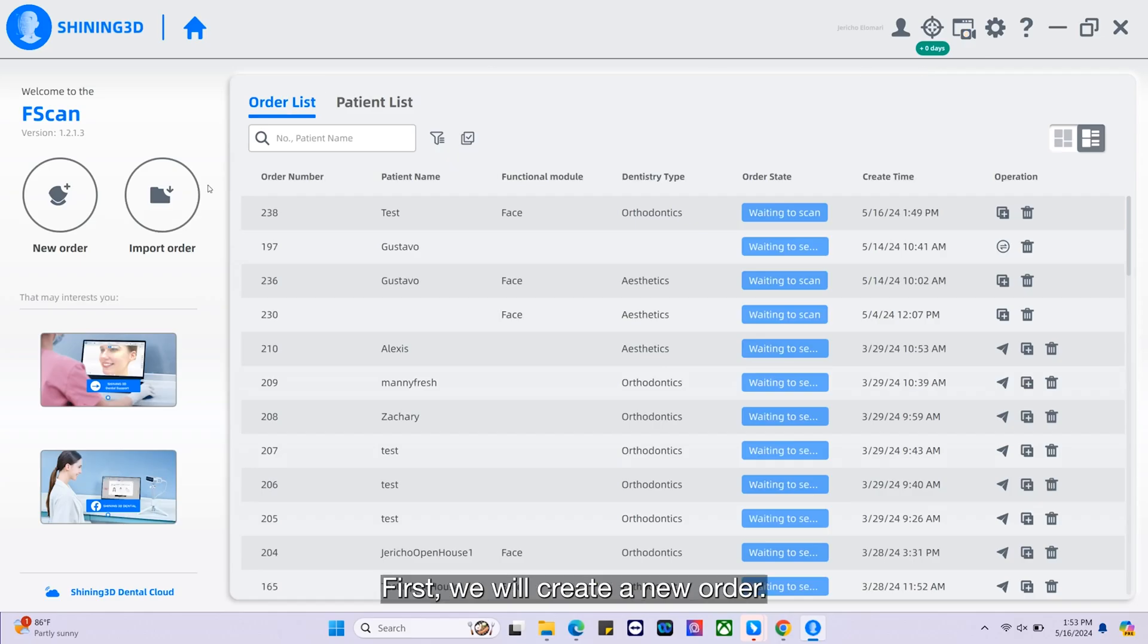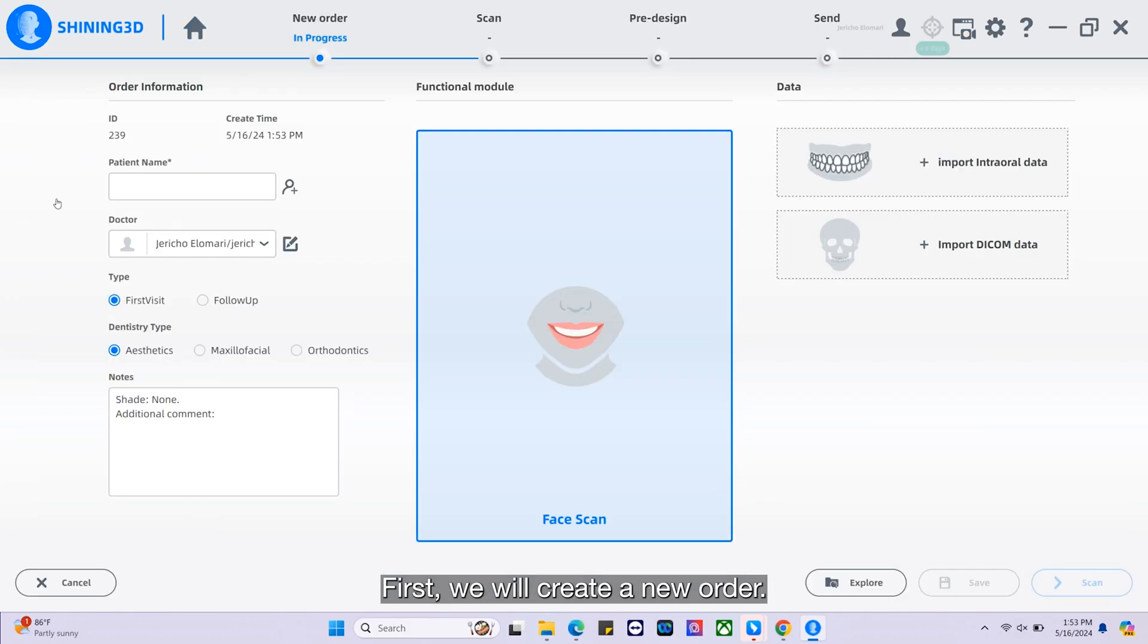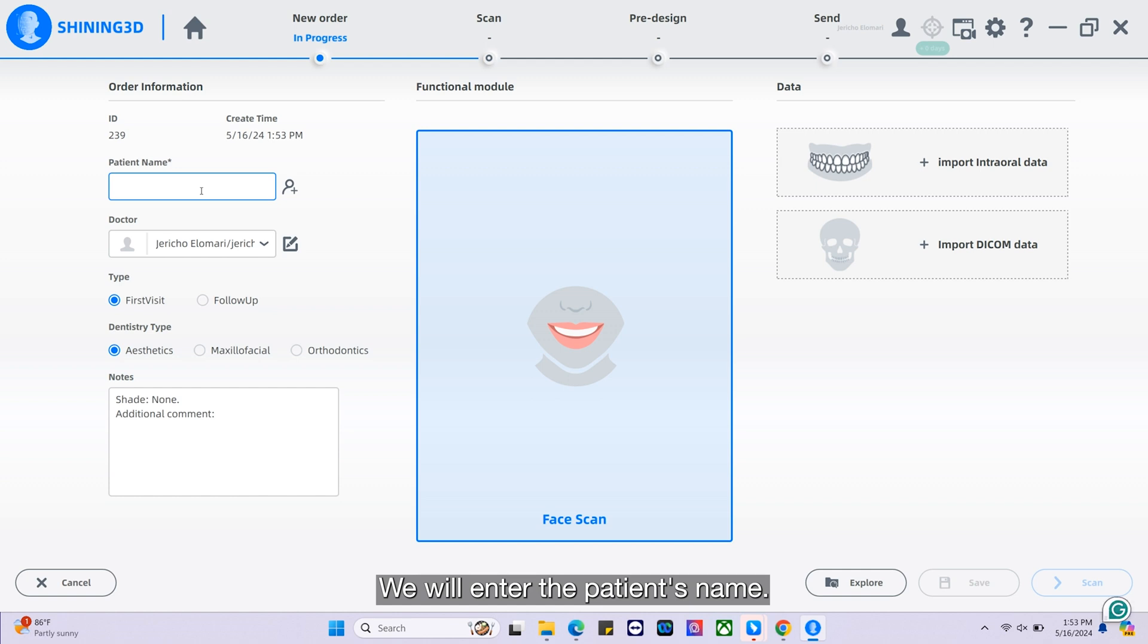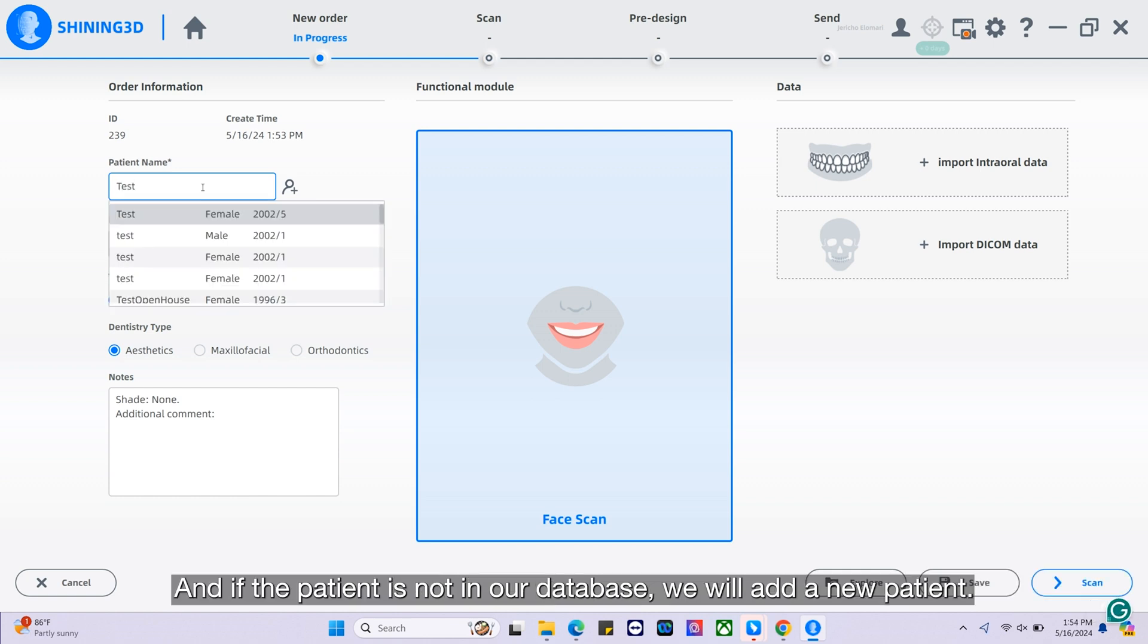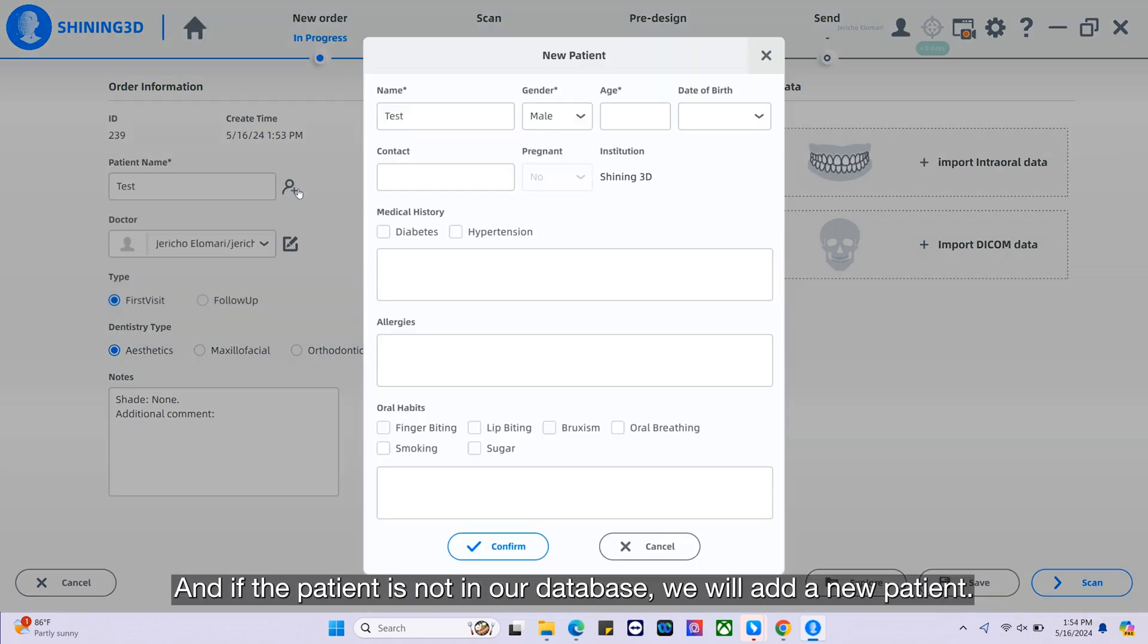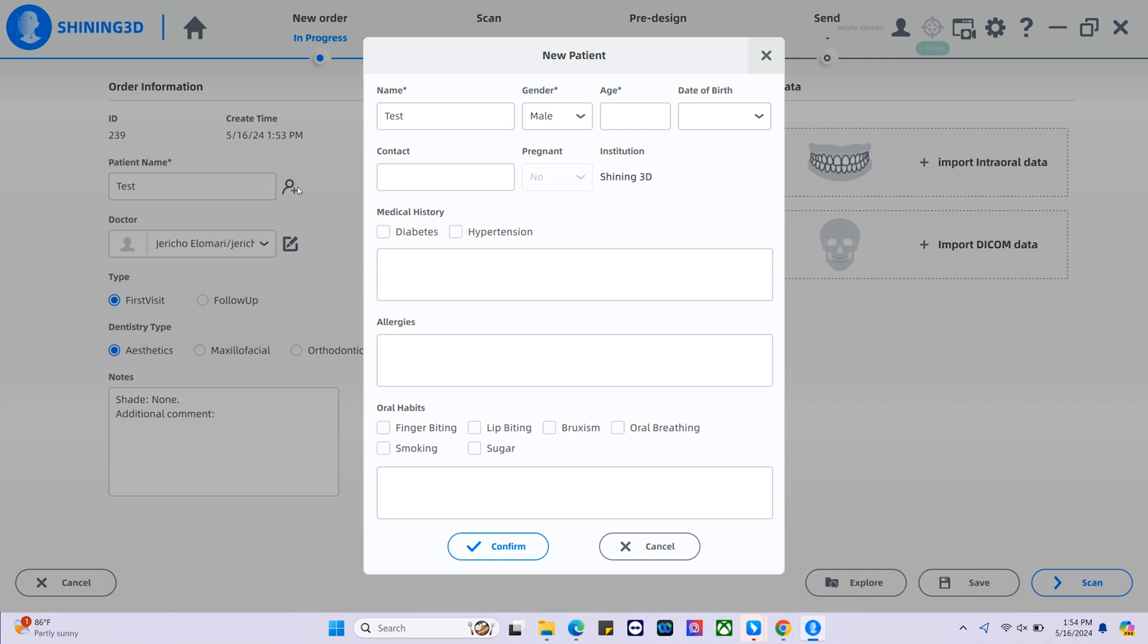First we will create a new order. We will enter the patient's name, and if the patient is not in our database, we will add a new patient.